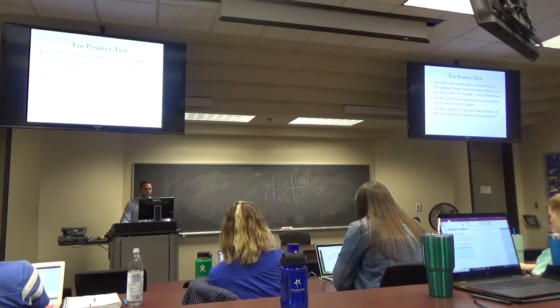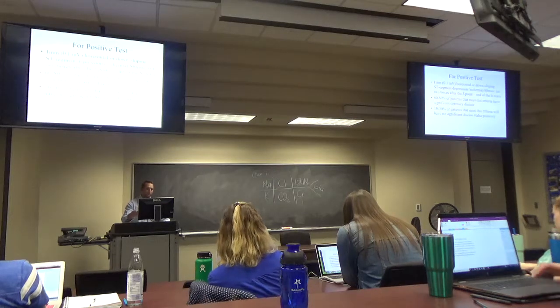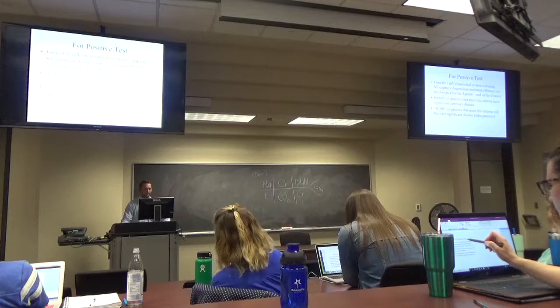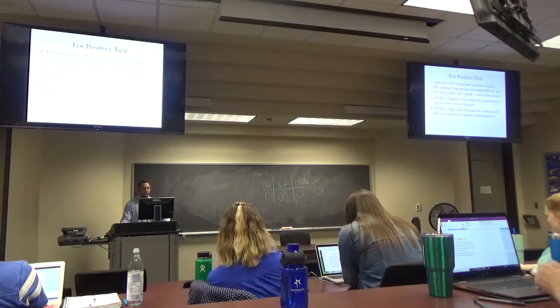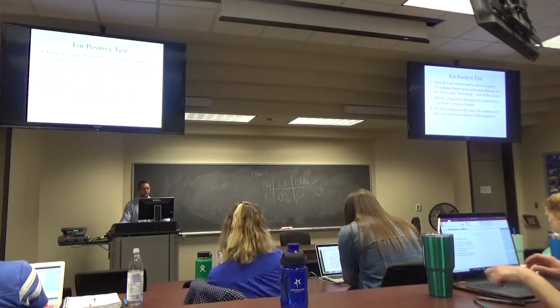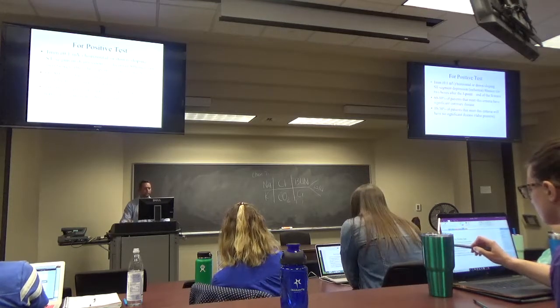For a positive test, you need 1 millimeter of ST depression, or there's something called the J point at the end of the S wave. If you have a downsloping of that J point by 1 millimeter, it's the same thing. Around 70% of the patients that meet this criteria have significant disease. There's going to be some false positives, around 20%.